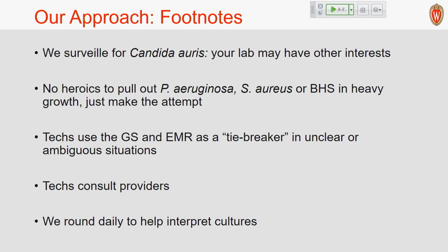The techs look at the gram stains a lot, but they really rely on it, as I mentioned, in the cases where it's not clear cut. You may get pure culture of Staph aureus, where you don't need to look at the gram stain, right? If it's more mixed, it's like, maybe I should, maybe I shouldn't. Let's see what white cells are there. And I've already mentioned the EMR. Encourage your techs to do that. Techs call providers, and then you as managers and directors of the lab, get out there, and I'm sure many of you do, and encourage your techs to get some input, and maybe you make that call.